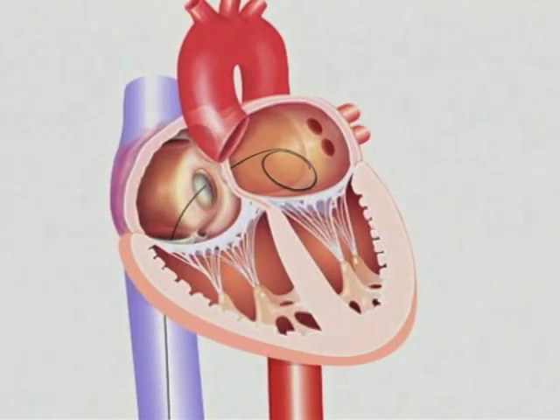Administer heparin to raise the ACT level over 400 seconds. Advance the two-stage dilator over the guide wire until the largest diameter section enters the left atrium. Then remove the dilator.